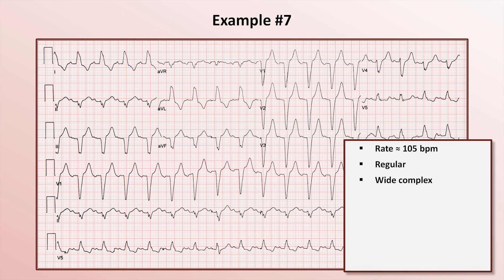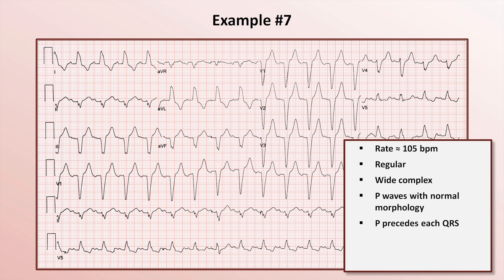Do you see P-waves? Yes — they are most clear in lead 1, but also unambiguous in leads 2 and AVF, and the morphology seems about normal. Each P precedes a QRS, and each QRS follows a P.